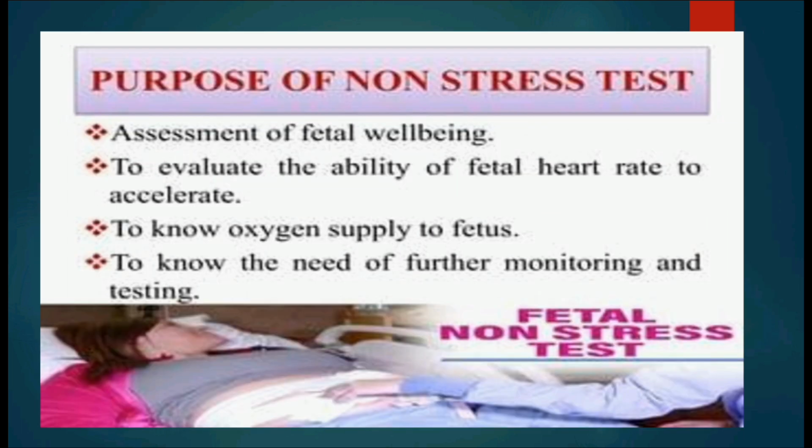Now, what is the purpose of non-stress test? Assessment of fetal well-being, or to evaluate the ability of fetal heart rate to accelerate, to know the oxygen supply to the fetus, and to know the need of further monitoring and testing.